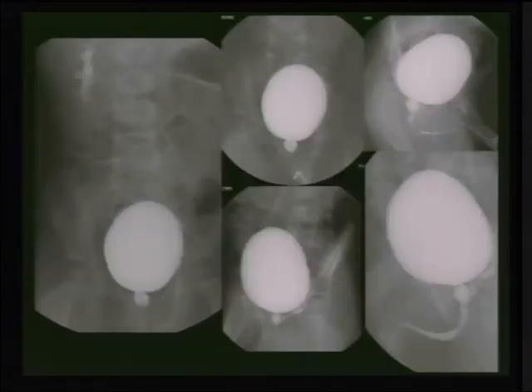And this is an example of Hinman syndrome, or non-neurogenic neurogenic bladder, where you find in this male the bladder looks like a neurogenic bladder, trabeculated, elongated, and the child tries to micturate. Look at the posterior urethra. It is dilated, but the external sphincter is closed. They pass very little, and they stop. Very little, and they stop. They behave like a neurogenic bladder, but it is not a neurogenic bladder.